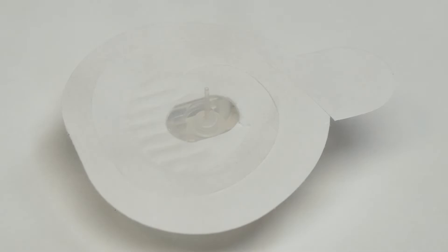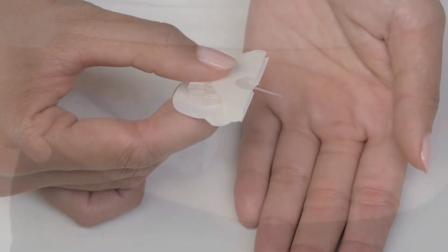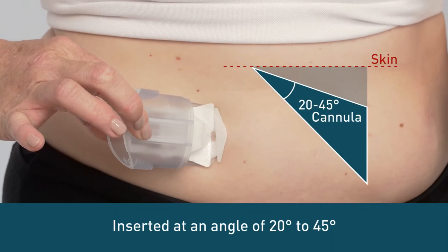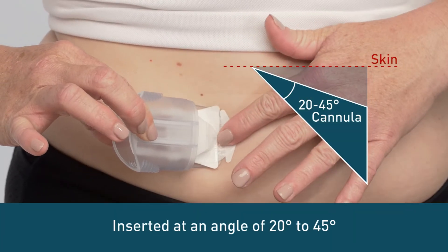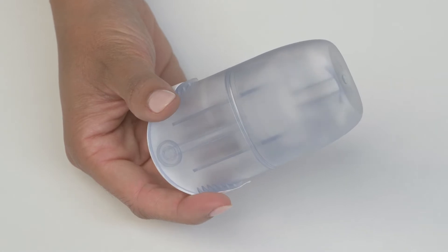The biggest difference between infusion sets is the cannula. There are three different types of cannulas. Angled sets are designed to be inserted at an angle of 20 to 45 degrees relative to your skin, with a cannula length of either 13 or 17 millimeters. These cannulas are made of a soft plastic and can either be manually inserted or used with an insertion device.